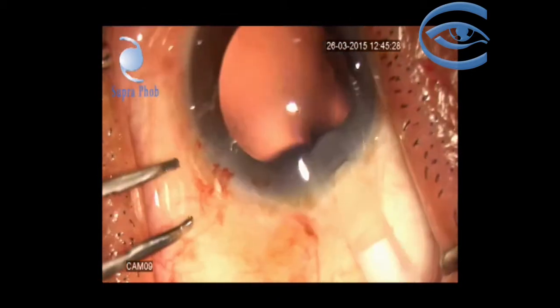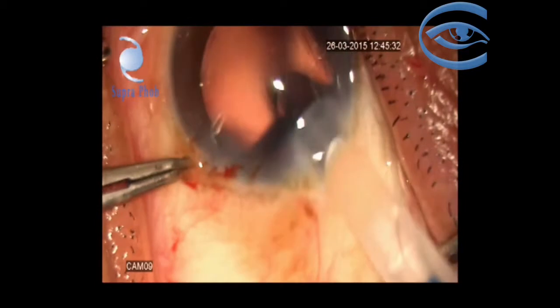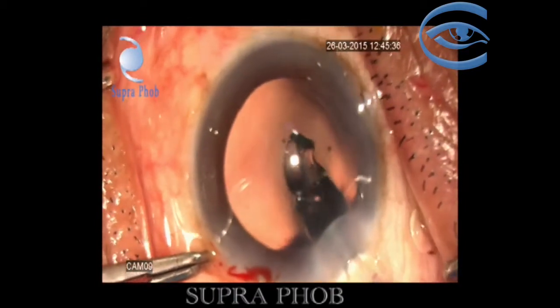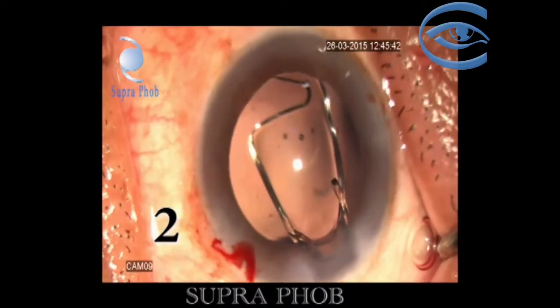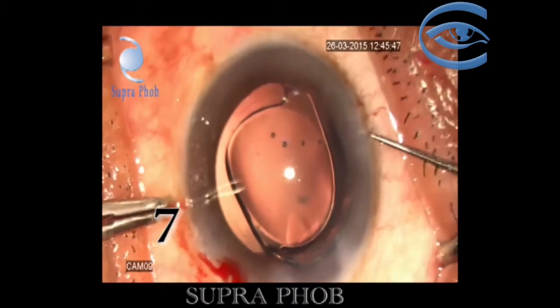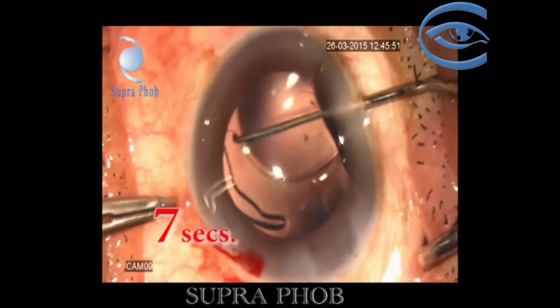The leading haptic could be guided into the capsular bag during the implantation process. The trailing haptic is then dialed into the capsular bag with the help of an IOL dialer.